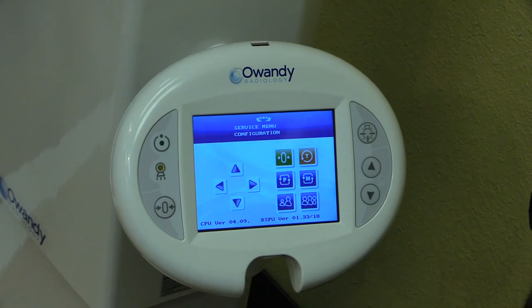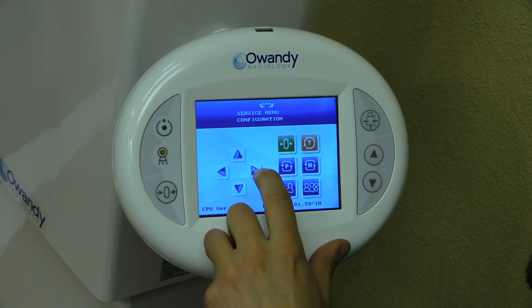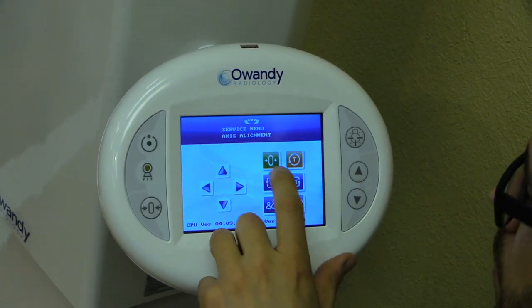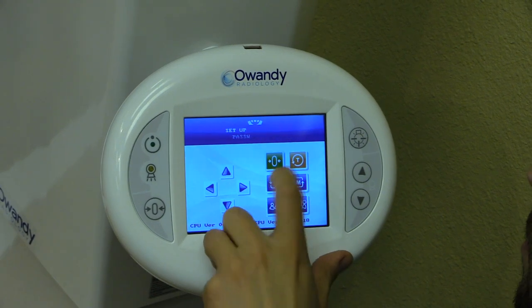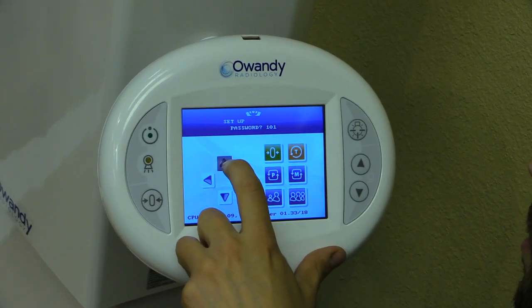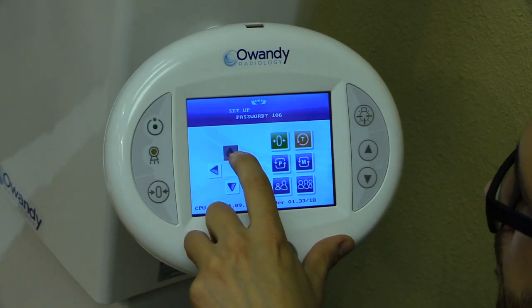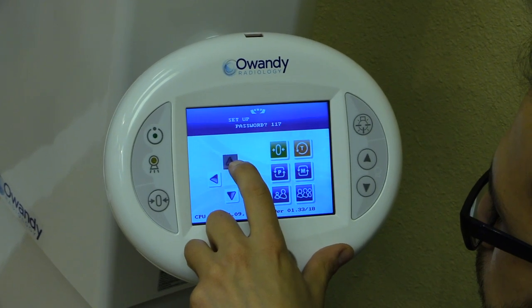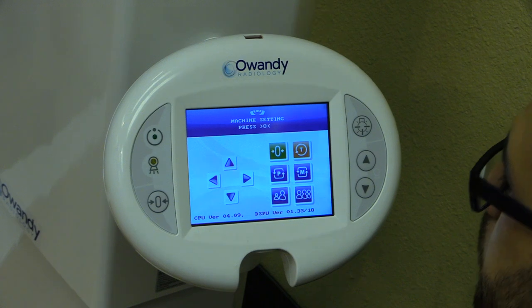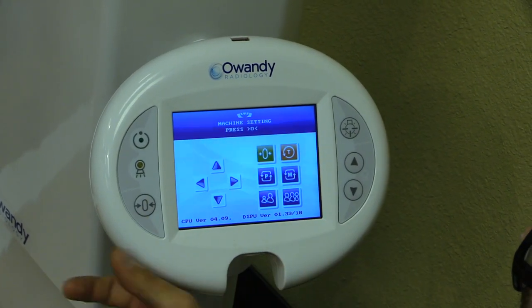To begin the alignment procedure, navigate right one time from the service menu. When you see 'service menu access alignment,' press zero to enter. The password for the access alignment menu is 118 — use the up arrow until you reach 118. Once on 118, hit zero, and the machine will ask you to press zero again to initiate.